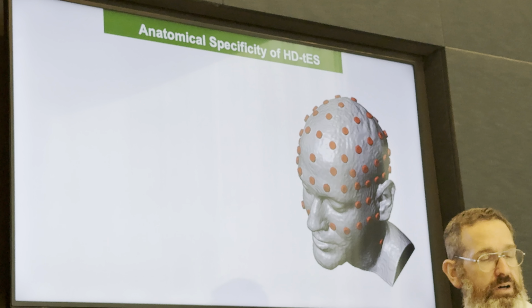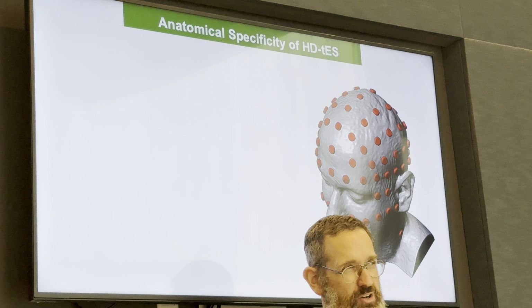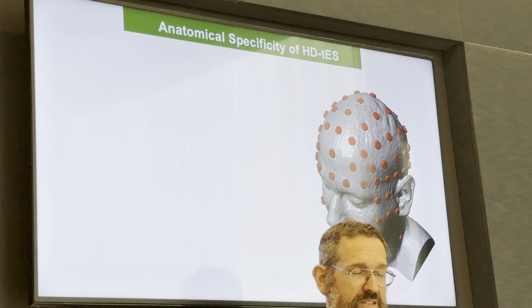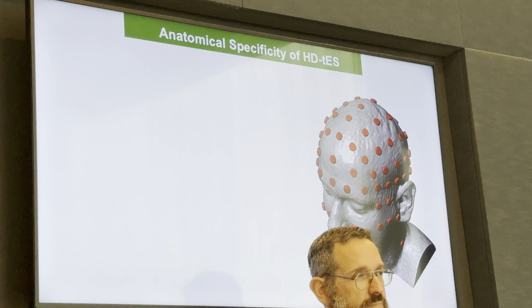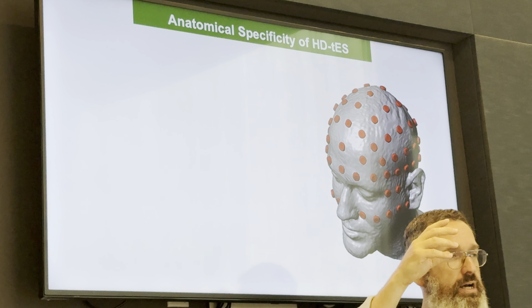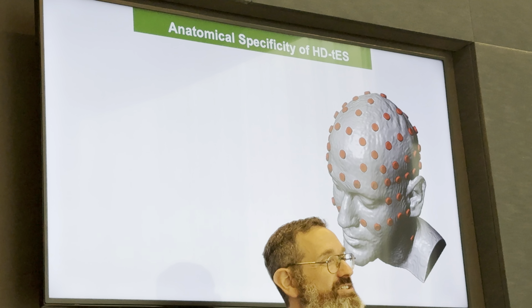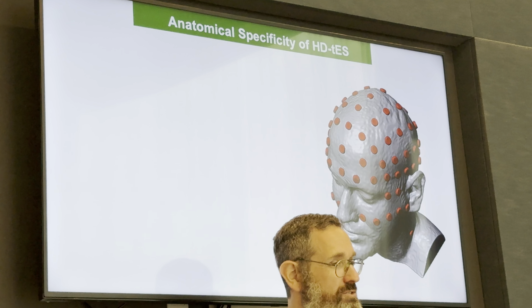The last thing I want to transition back to is this notion of montage, because I spent a bit of time talking about frequency. Let's talk a little bit more about montage. If you remember, the first aspect of dose is where you put the electrodes, right? How big they are.